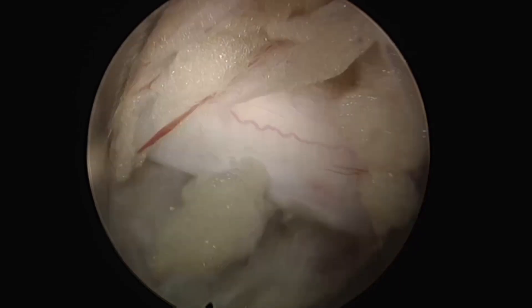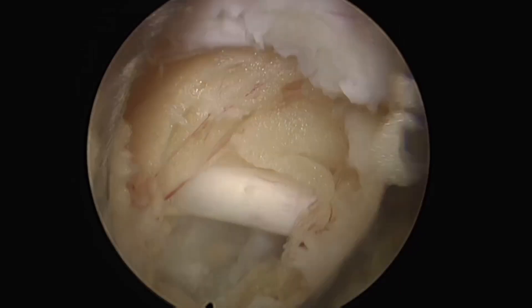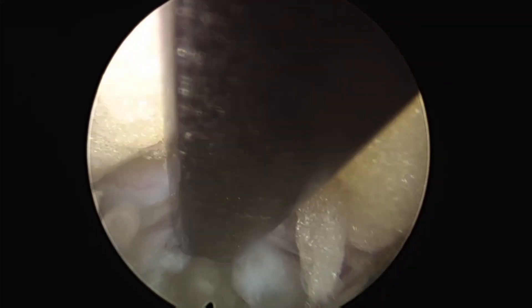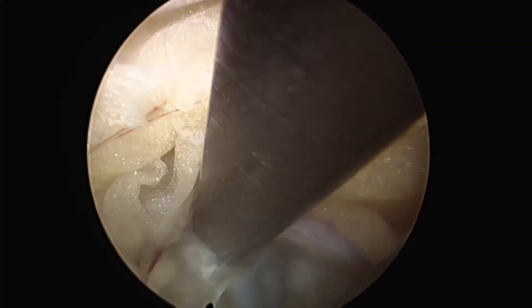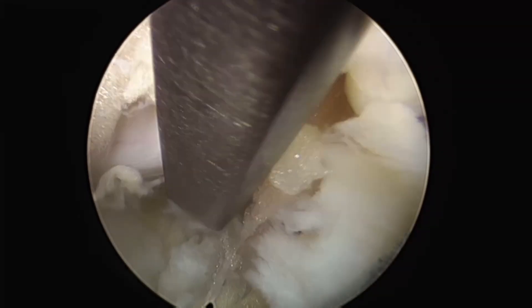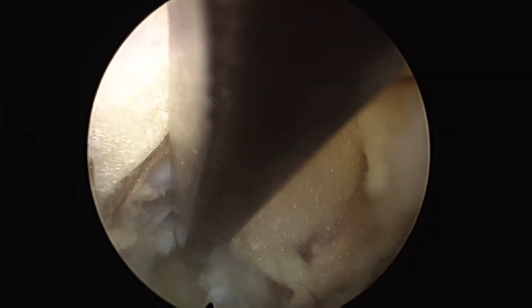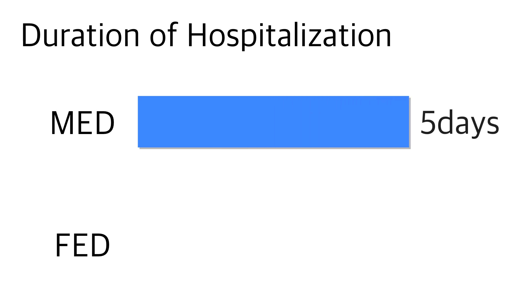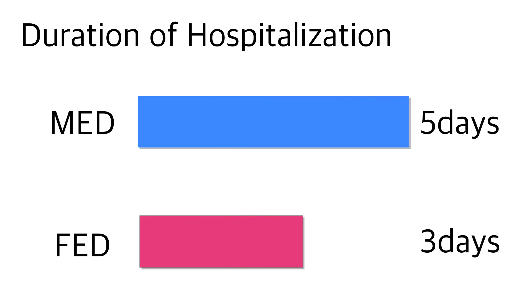Since the sleeve itself may be compressing residual tissue, the sleeve is removed at the end to confirm that there is no residual disc herniation. In this way, partial flavectomy allows for a clear anatomical view, enabling a better understanding of the spatial relationship and preserving the lamina, while also being a safer method that avoids the blind insertion of punches.